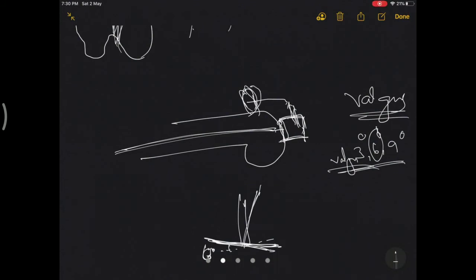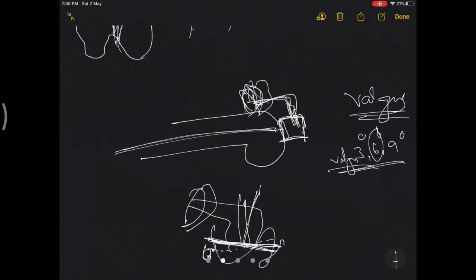distal femur, the anterior aspect of the distal femur, and whatever change you make here is reflected on the jig which is attached. Getting it? Okay. How much you change here is extended like this on this jig. Likewise, you adjust this jig and it has a saw capture, and you do a distal femoral cut.